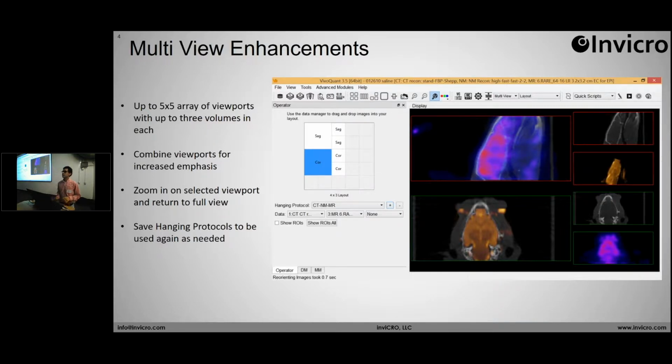And if you have some radiology background, you might be familiar with hanging protocols, where there are predefined sets of visualization setups. We've integrated those in with some customary defaults, and you can save your own visualization setups to disk to use later, share them with users, and so on.